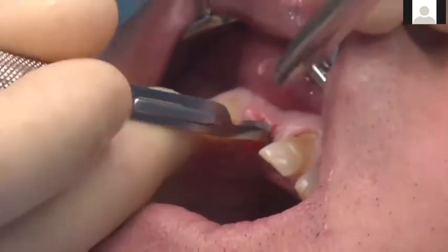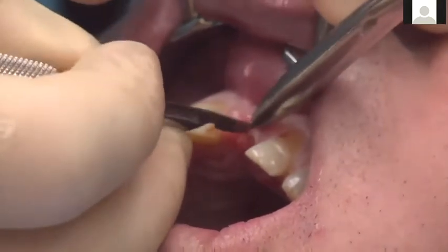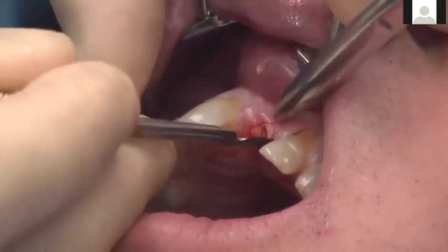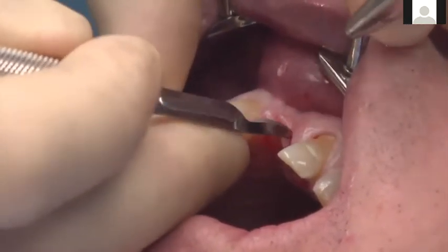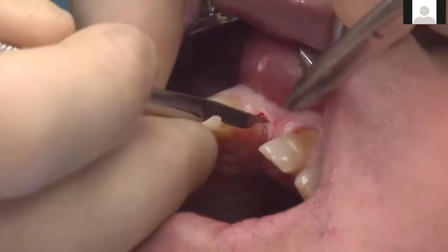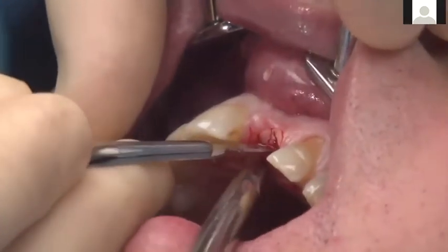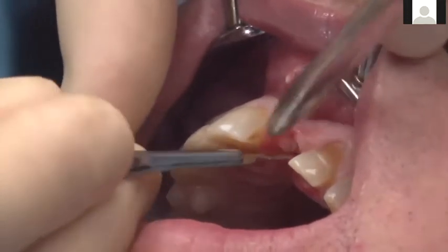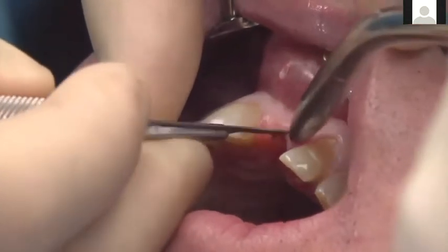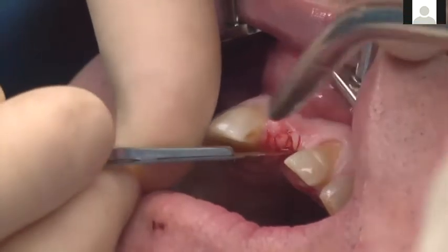You'll have a lot of tissue tags. In this case, as you know, we're very close to the incisive neurovascular bundle in that orifice, so you're going to excise some of those fibers as well. So just take your time and really outline this very well to the bone. You can see here we go around multiple times. It may look like we do it too much, but it really is important to make sure that you get a good, solid, clean incision all the way to the bone, and you won't always get that with the punch.